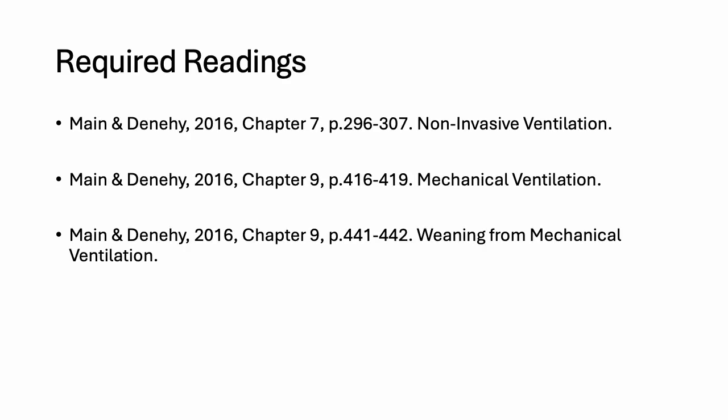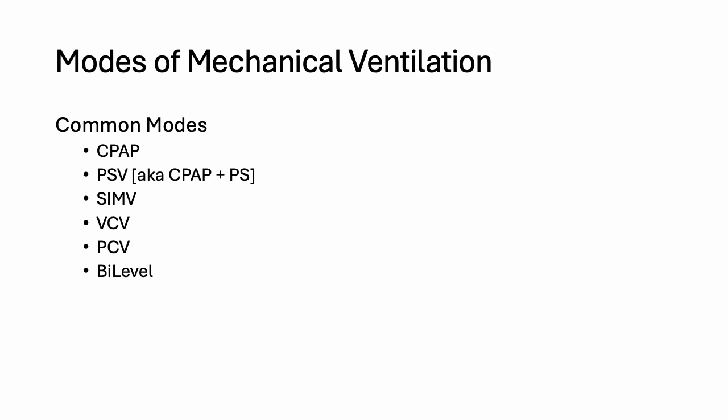Again, the required readings. As illustrated in the first part, these are some of the common modes of mechanical ventilation. These are the standard abbreviations, and the full form will be in all the subsequent slides. As I mentioned before in part 1, regardless of what proprietary names or brand names the manufacturers put on the modes, they all refer to one of these modes, the so-called generic names that have been created to describe the actual mode of ventilation.